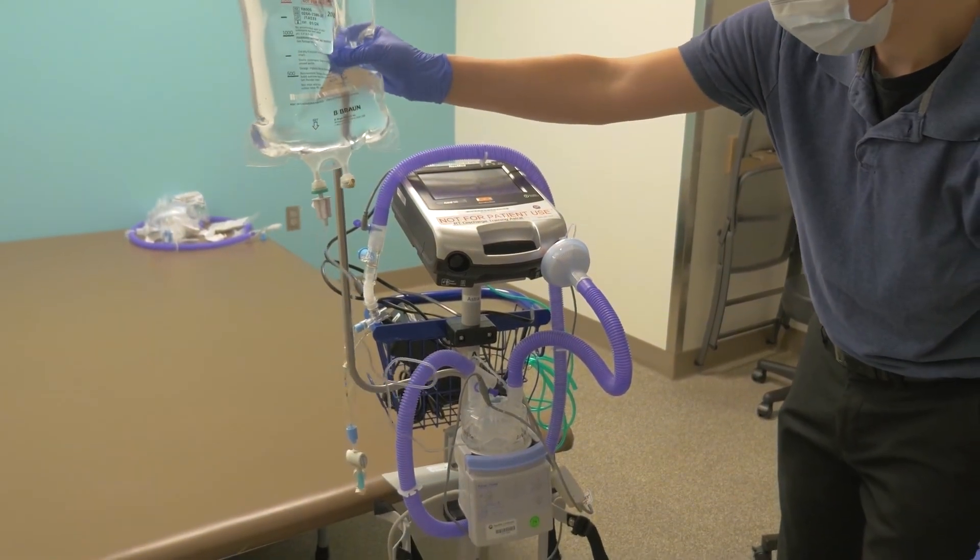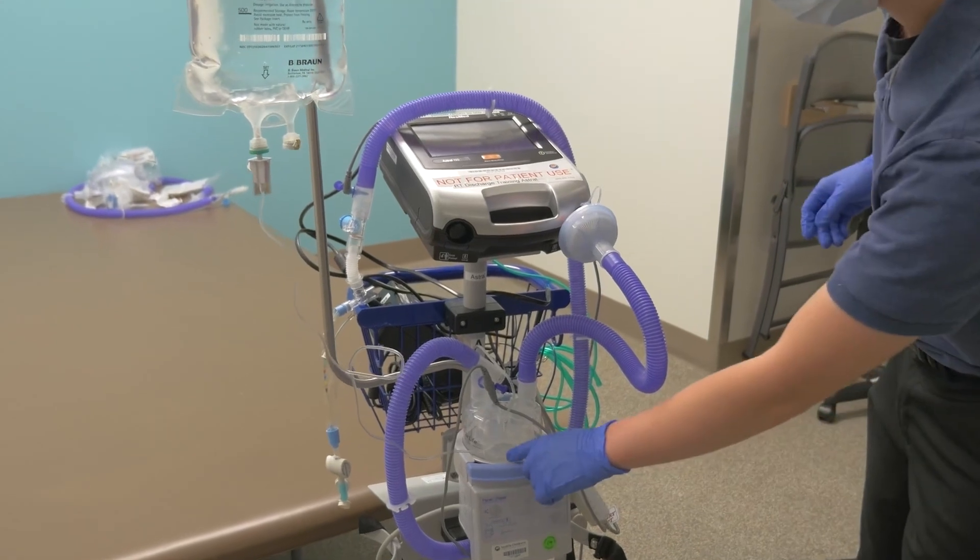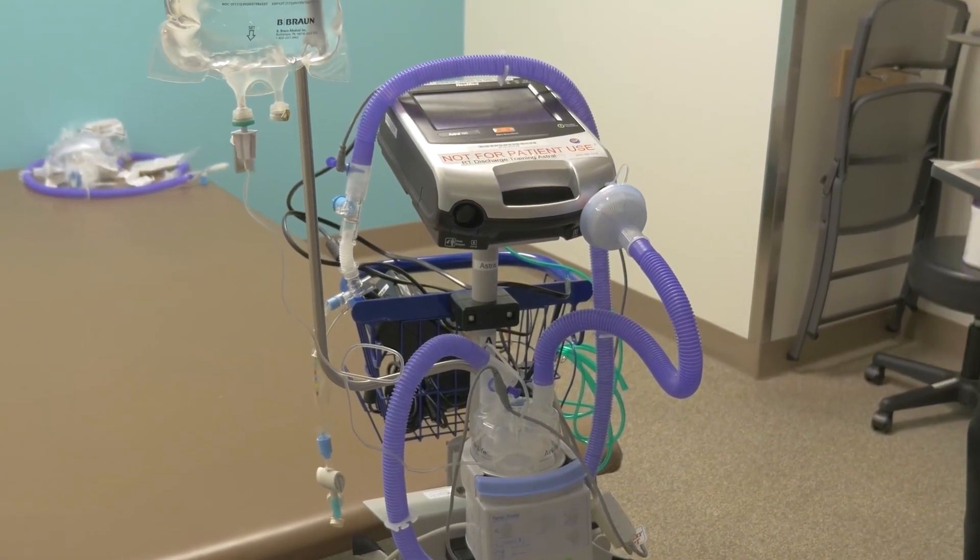Press start on the screen to begin ventilation before attaching it to your child, and don't forget to turn on your humidifier.